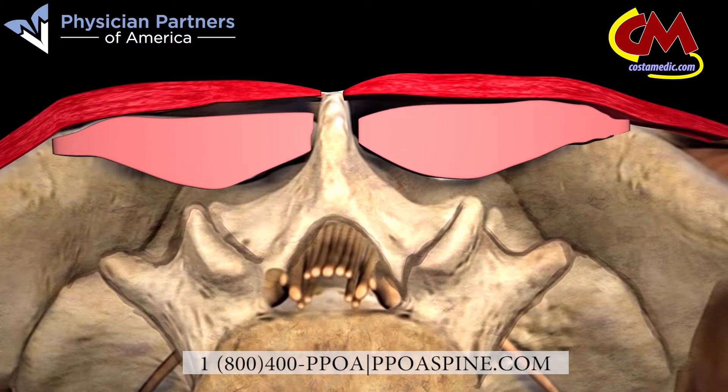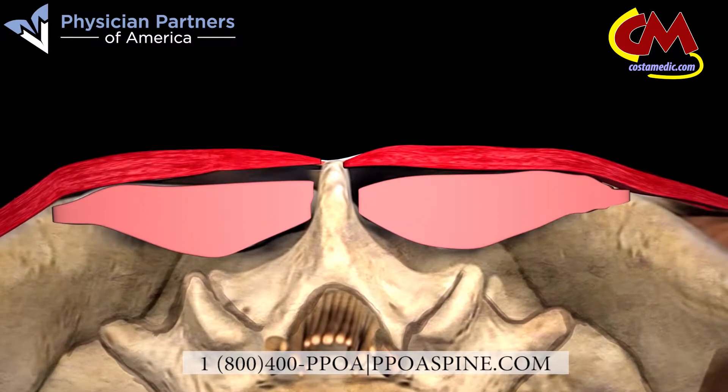With our minimally invasive laser procedure, muscles are gently dilated, allowing our physicians to get clear access to the area they are treating without causing serious trauma to your back. When the procedure is complete, your muscles gently return to their normal state.